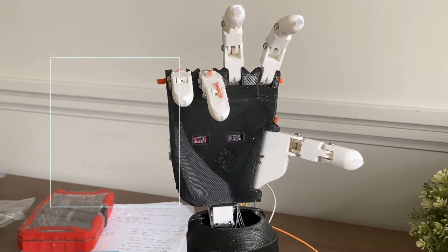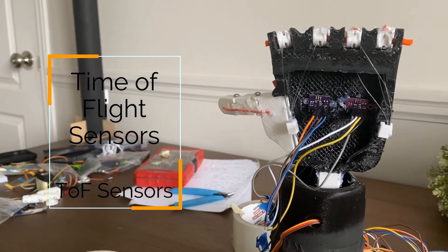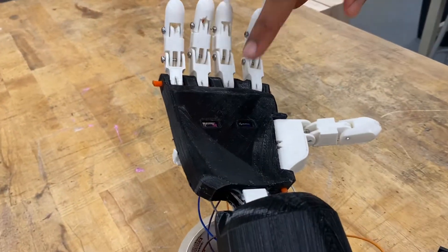My solution was to use TOF sensors, or time-of-flight sensors, where they measure how distant an object is from itself by measuring the time taken for the wave pulse emitted from the sensor to reach the object. They're inexpensive, quite reliable, and work very well for this prosthetic arm.